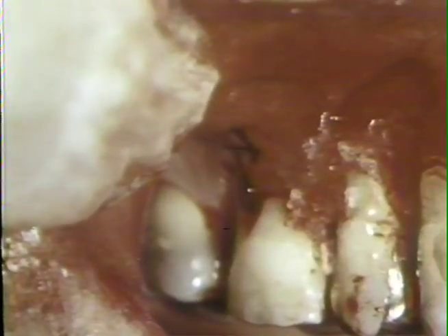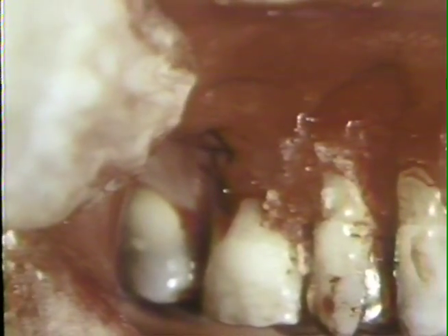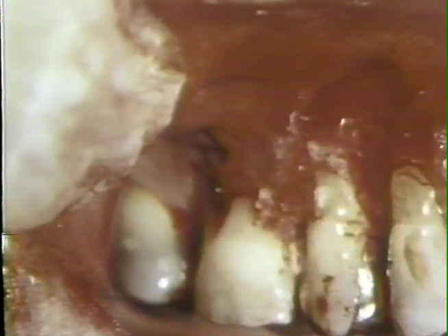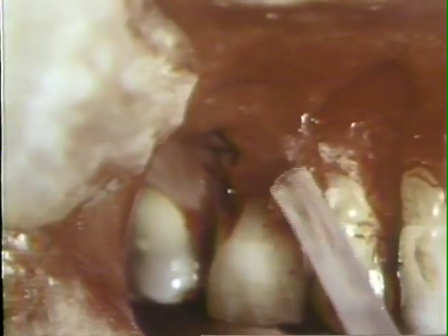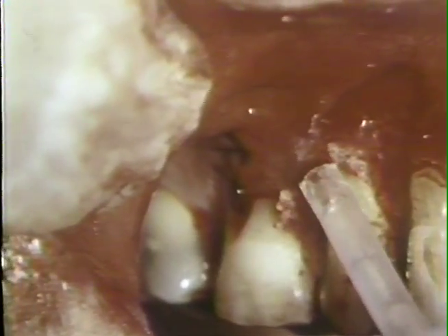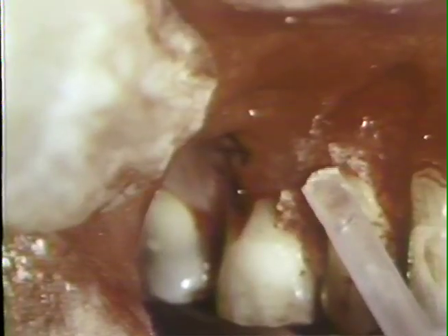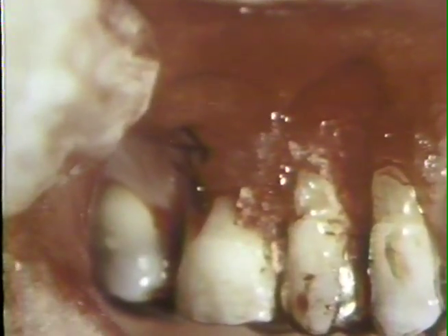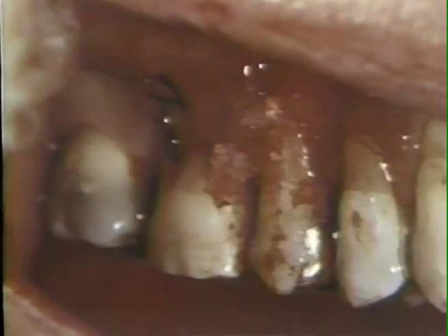Additional sutures are placed along the distal margin of the flap. The mesial margin is secured with a tissue adhesive, isobutyl cyanoacrylate. This material has been provided by Ethicon Incorporated in Somerville, New Jersey.